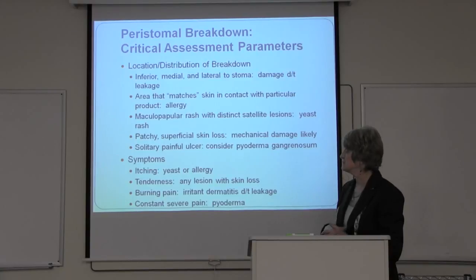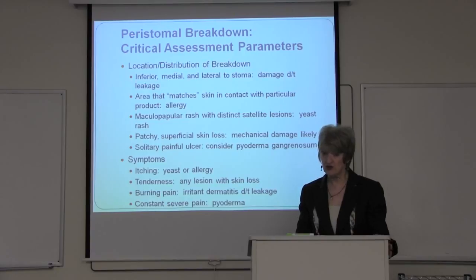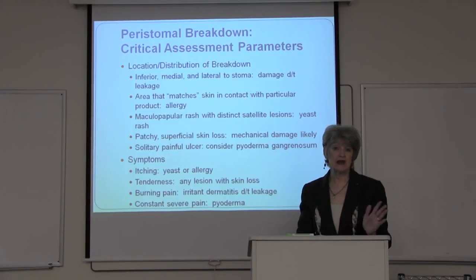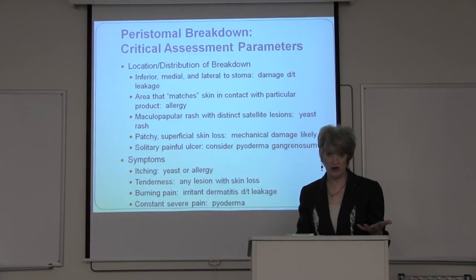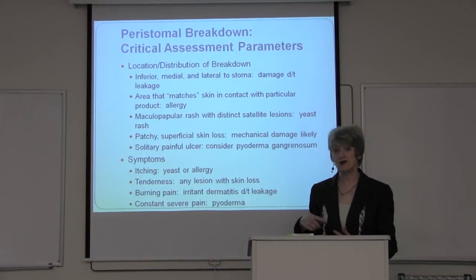In terms of symptoms, patients who complain of itching almost always either have a yeast rash or an allergy. If they complain of tenderness, it could be any type of skin loss. So tenderness can go along with mechanical damage, can go along with early damage due to drainage. Burning pain is that irritant dermatitis caused by contact with drainage.